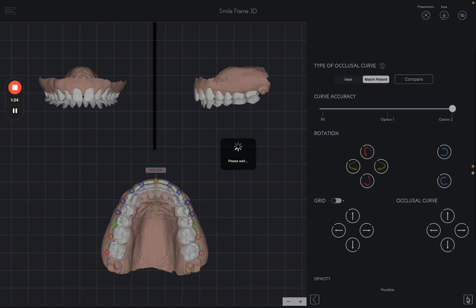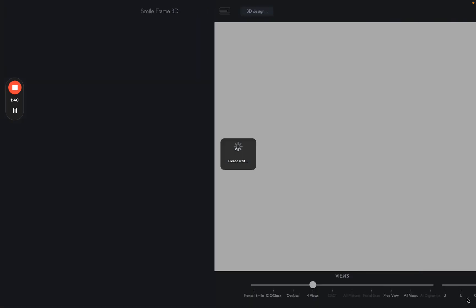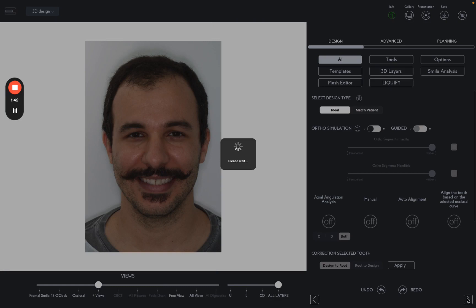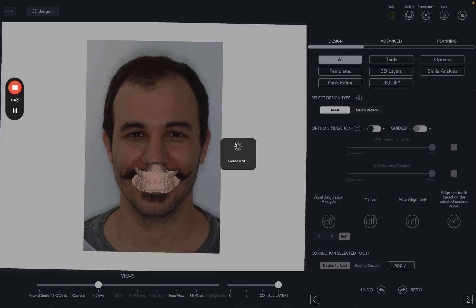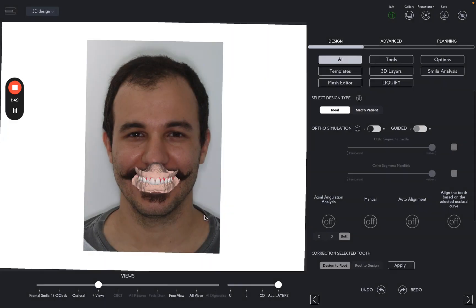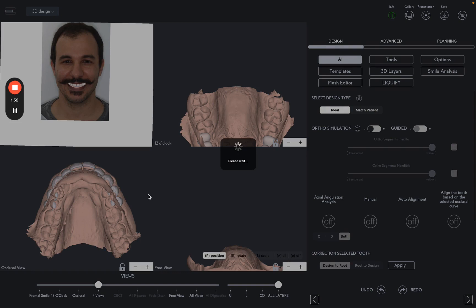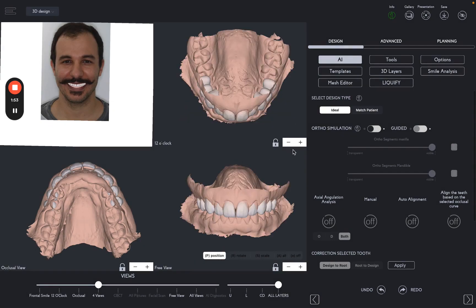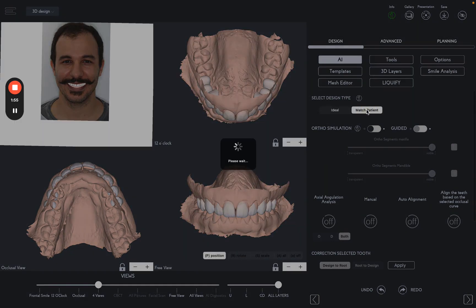Based on the position of the occlusal curve, the AI creates a 3D smile design according to the red proportions, or the position and proportions of the patient's current teeth. I'm going to select Match the Patient.